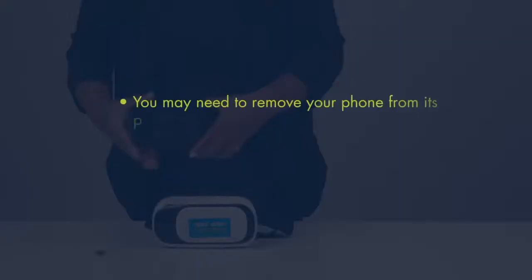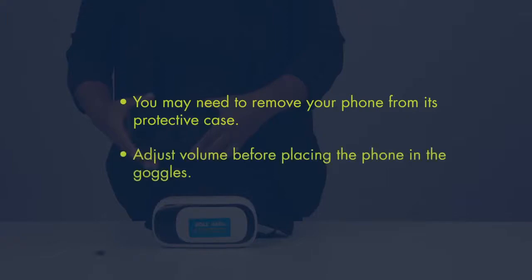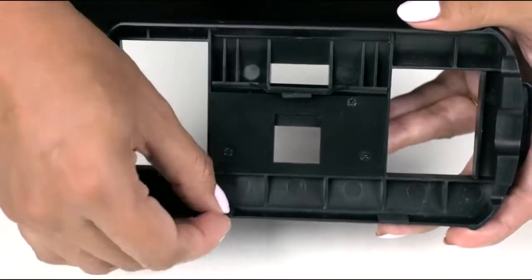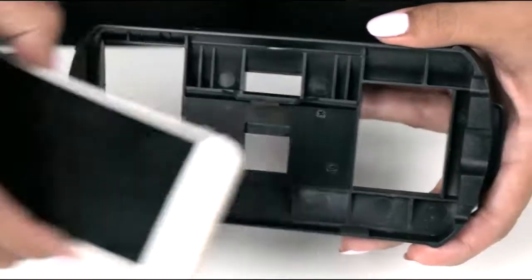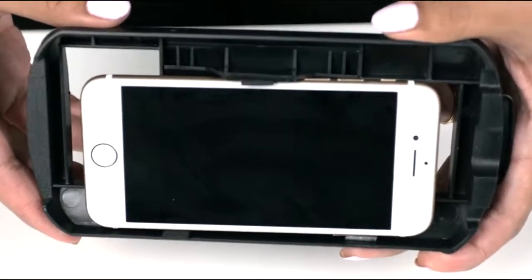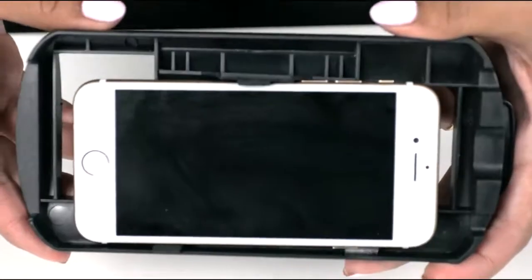Note that before placing the phone in the goggles, you may need to remove it from your protective case if it's too large. It is also recommended that you turn your volume up to the preferred level before inserting it into the goggles. Lay the phone cradle face up on the table. Line up your phone in the center of the cradle. Taking the small black spacers, align and place them in the phone holder so that they prevent the buttons on the side of your phone from making contact with the holder.